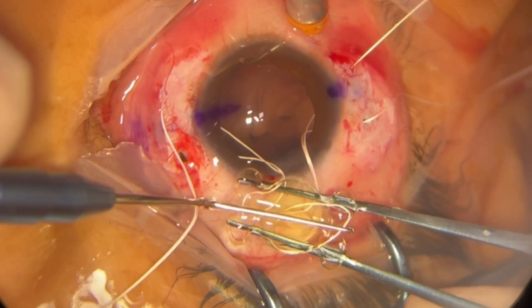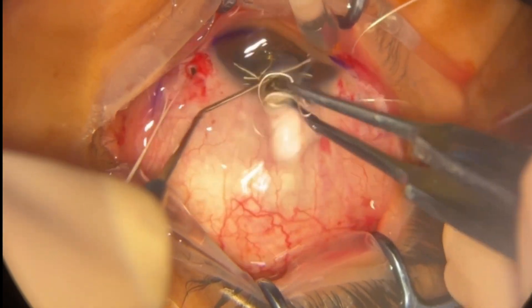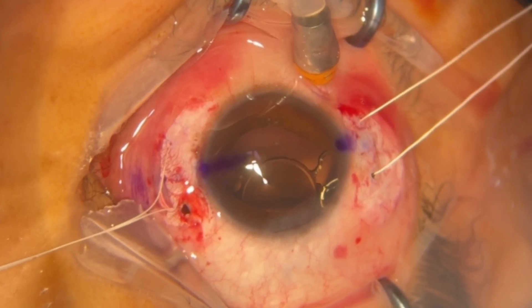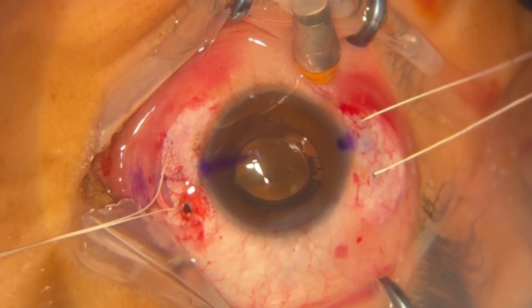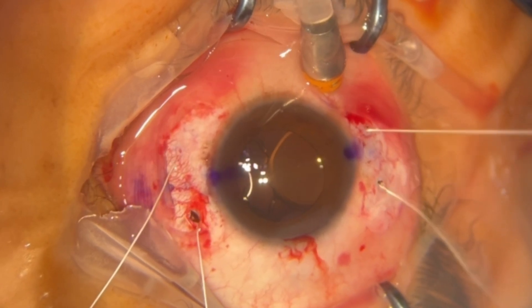With the help of a chopper and a Macpherson forceps, the lens is folded and introduced through the 2.75 mm corneal incision. However, the temporal side of the Gore-Tex thread is accidentally lost, causing the lens to dislocate into the vitreous cavity.